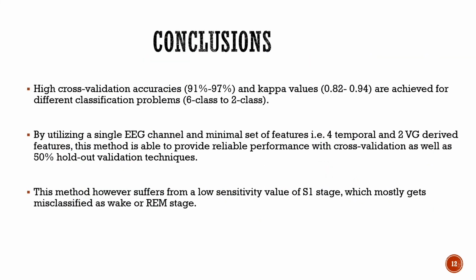Now, coming to the conclusion. As I already mentioned, we have achieved a high cross-validation accuracy ranging from 91 to 97% and a kappa value of 0.82 to 0.94, which shows a very high agreement between the score by the experts and that of the proposed method.